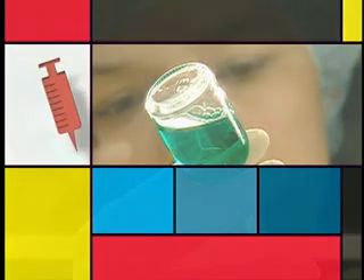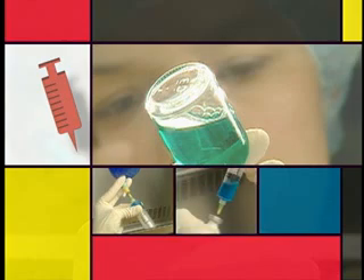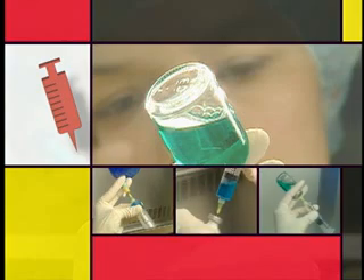In the following procedures, we will see how to withdraw diluent from a solution bag, how to reconstitute a powdered medication in a vial, and how to withdraw the reconstituted medication from the vial.